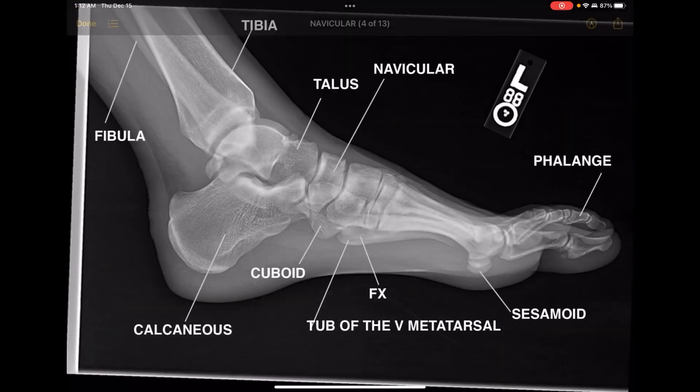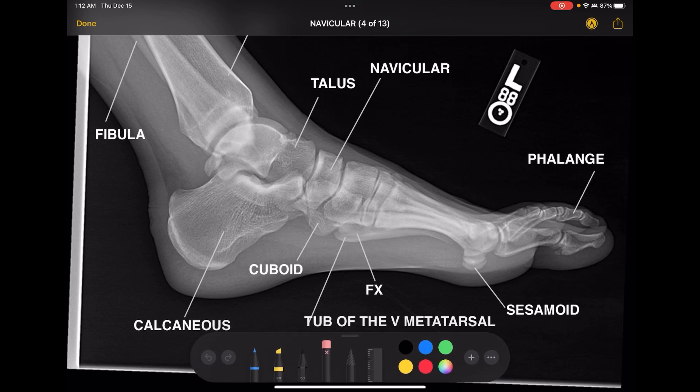This is a much better picture of a lateral foot. You can see the metatarsal heads are nice and superimposed. The dome of the talus is not quite perfectly superimposed, but it's good enough, and you can see a nice open joint space between the tibia and the talus. This right here is the fibula — it needs to be overlapping the posterior portion of the tibia. Here's the talus, the navicular, the cuboid, and right here is where the tuberosity of the fifth metatarsal is. A lot of times you can see it if it's fractured.